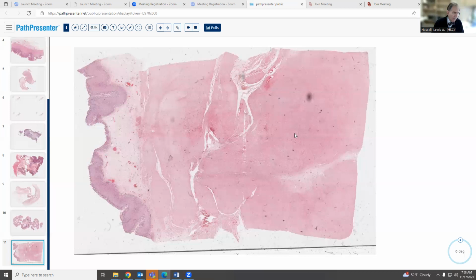So, what about the approach of just biopsying the upper esophagus? Do you think that if they just biopsied the upper esophagus and had an excess eosinophil count there, you could just make that diagnosis? Well, I would go more with eosinophilic esophagitis.